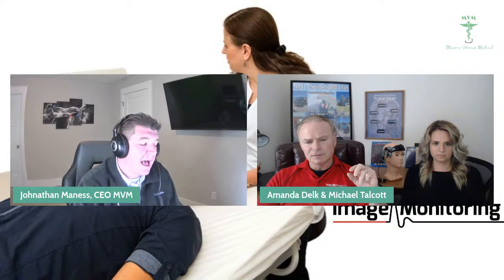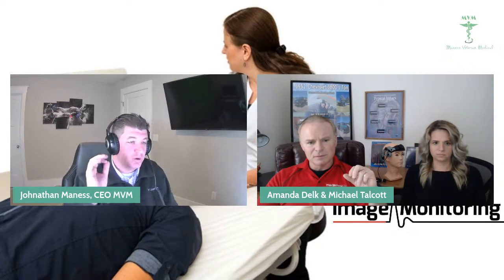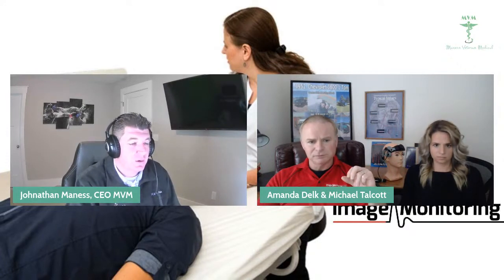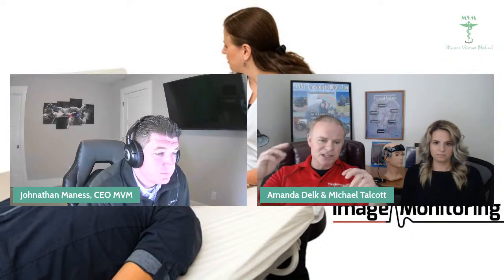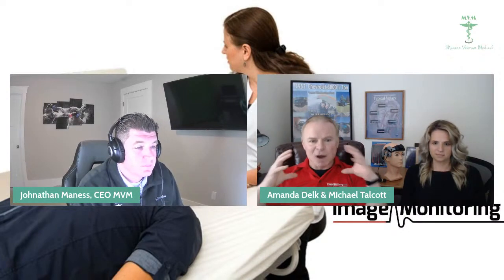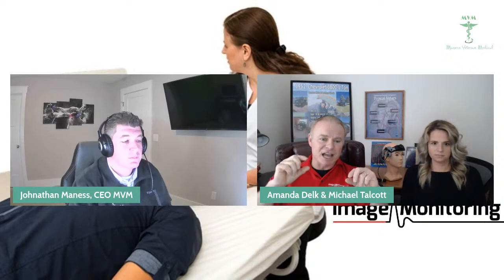And before we move on, from my understanding, what are we looking for when you're doing the Doppler? We're looking at blood flow. What else are we looking for? That's purely it. We're looking at blood flow and being able to tell whether it's high resistance or low resistance flow. Your brain, because it wants as much blood as it can get, is a low resistance bed. So we have certain velocity patterns and velocities that we look at to say whether it's normal or abnormal.